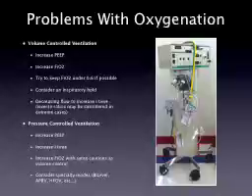I can also decrease my flow. If I decrease the flow, this will increase the I time. And I may consider something called inverse ratio ventilation, where my I time is actually longer than my E time.